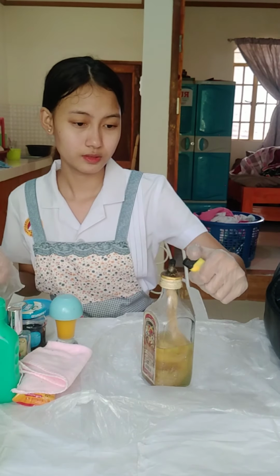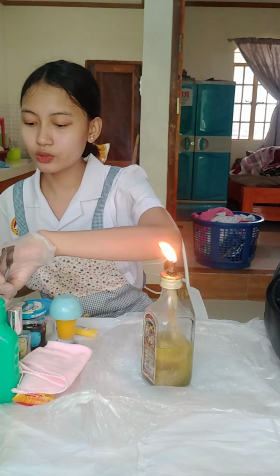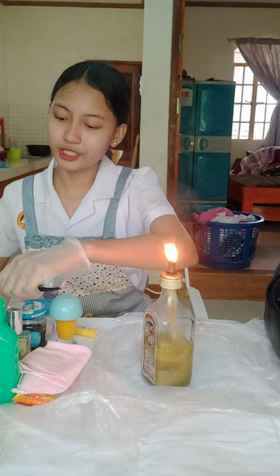And then after that, we need to light the lamp. And then fill the test tube about two-thirds full of urine.